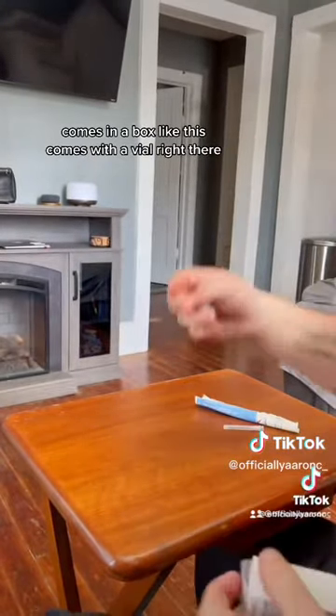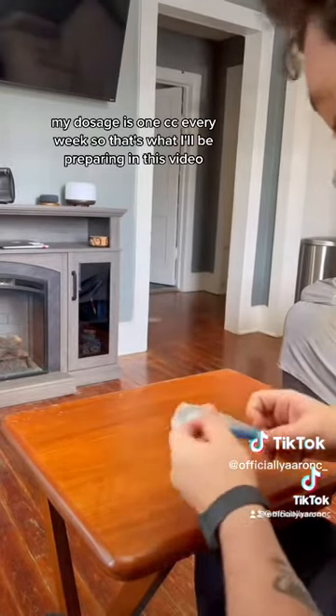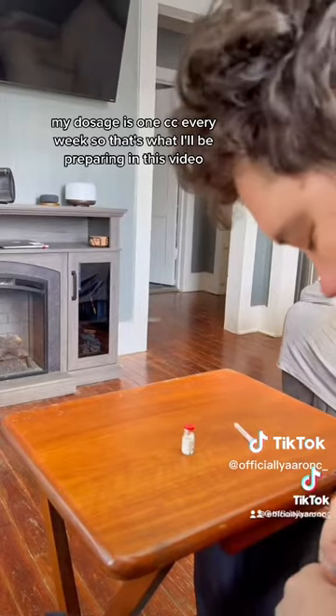It comes in a box like this, and it comes with a vial right there. My dosage is one cc every week, so that's what I'll be preparing in this video.